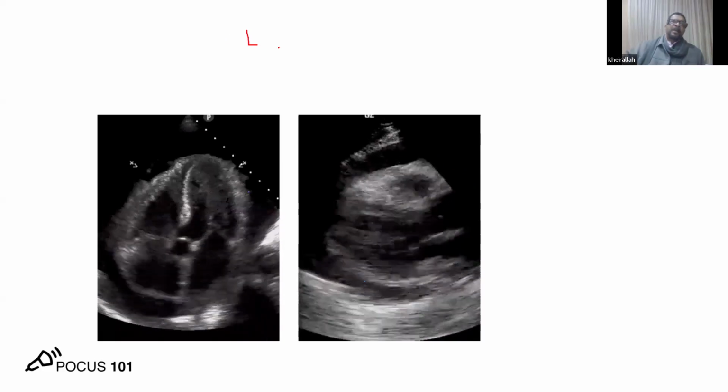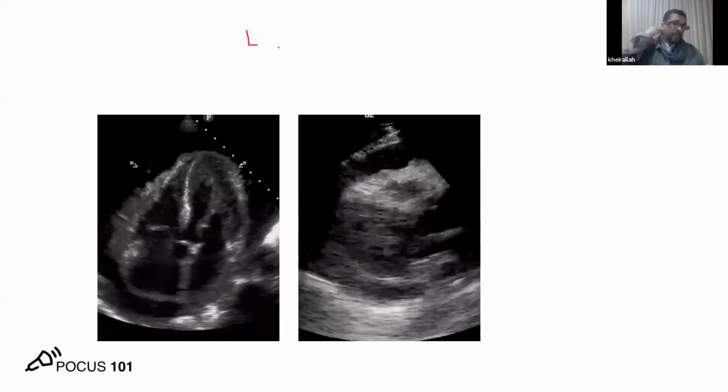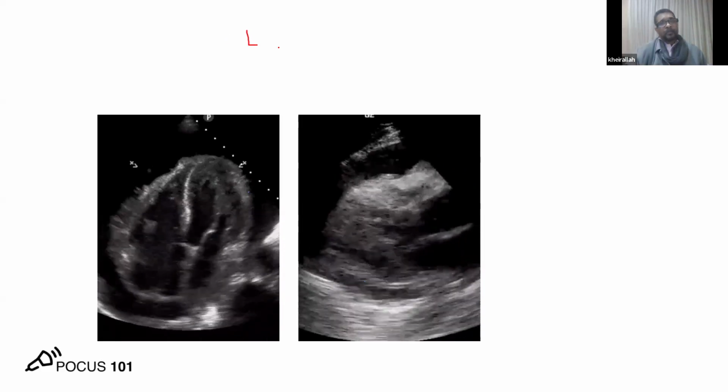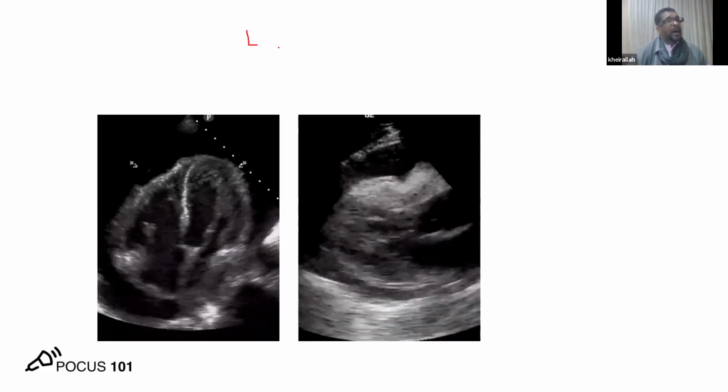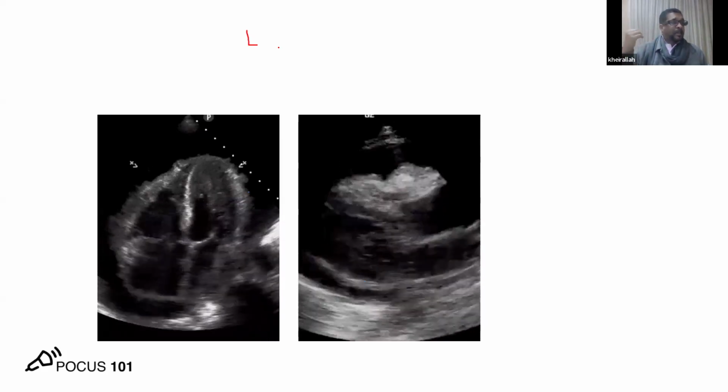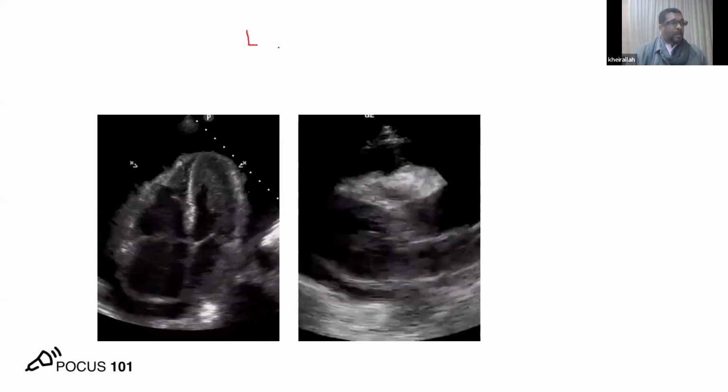The referring clinician is stuck what to do about this patient. Yeah, but if you tell him or her that this fluid is large and it's compressing the heart, as evidenced by so and so and so and so, he's probably gonna have a decision to make, and he's gonna probably stick a needle to drain this fluid.